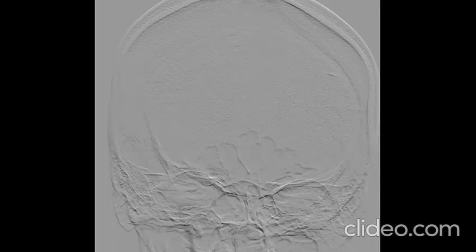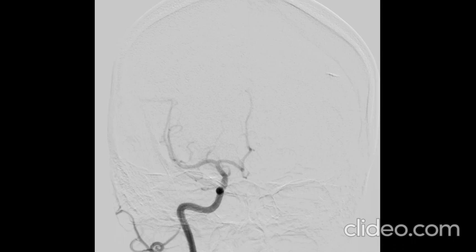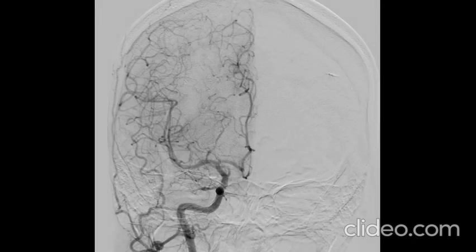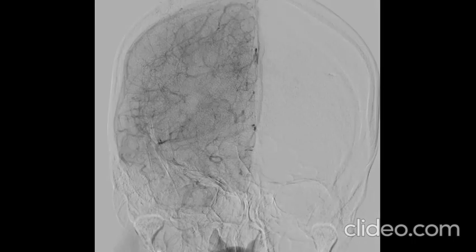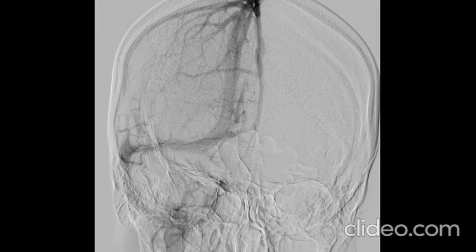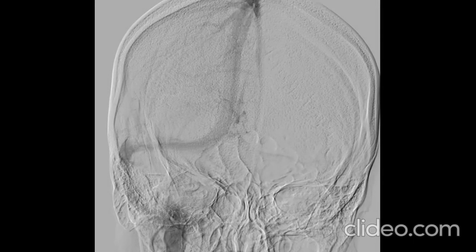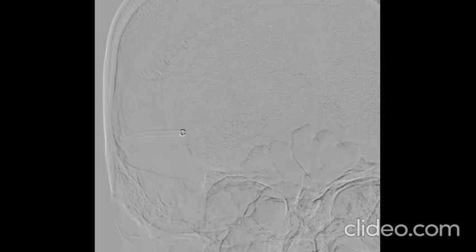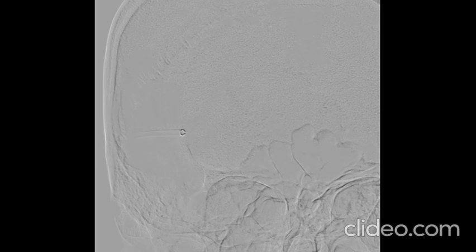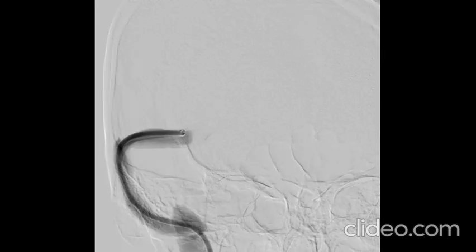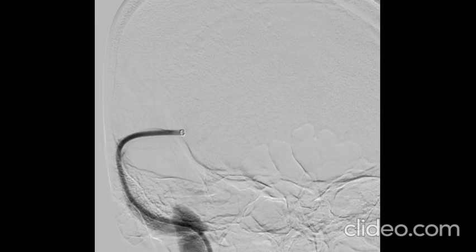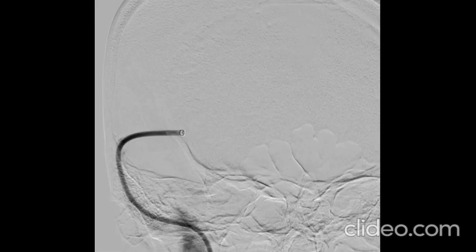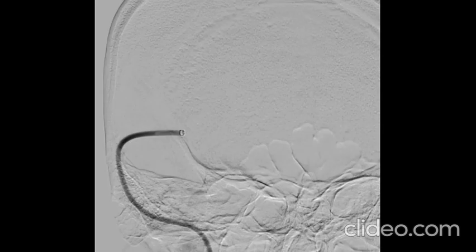A right common carotid artery injection of contrast showed good flow in the right hemisphere, and the venous phase shows a stenosis at the right transverse sinus–sigmoid sinus junction. The venous guiding catheter was placed in the jugular bulb and a distal access catheter was navigated up to the level of the dural sinus stenosis. The distal access catheter encountered an obstruction at the transverse sinus–sigmoid sinus junction.